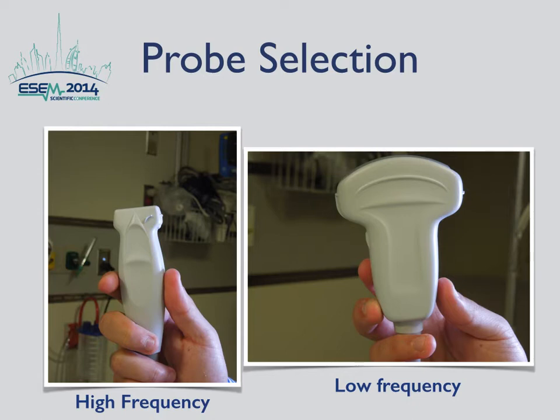You can perform the scan using a high-frequency or a low-frequency probe. We would prefer using a high-frequency probe as the image detail and quality is better compared to the low-frequency probe. But many hospitals only have one probe with their ultrasound, which is the low-frequency probe that you use for your FAST exam. If that's the case, you can still use the low-frequency probe to perform this exam.